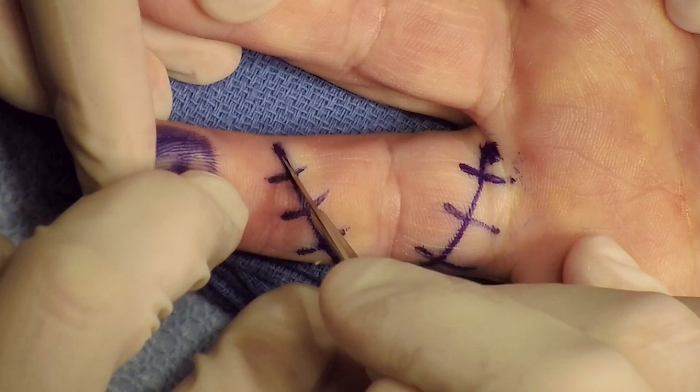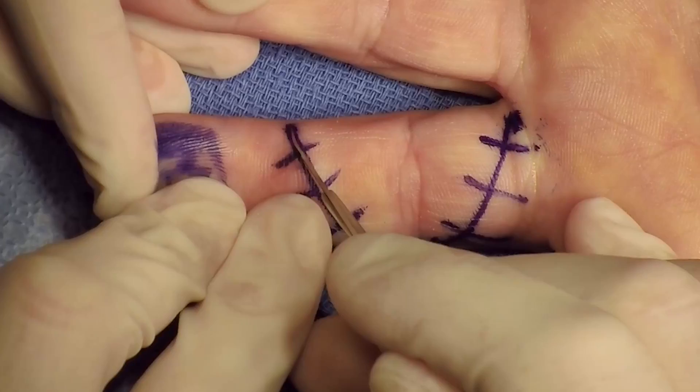Under digital block anesthesia with light sedation, a trapezoidal incision was made of the volar aspect of the proximal interphalangeal joint.